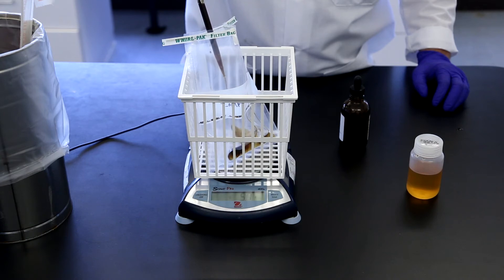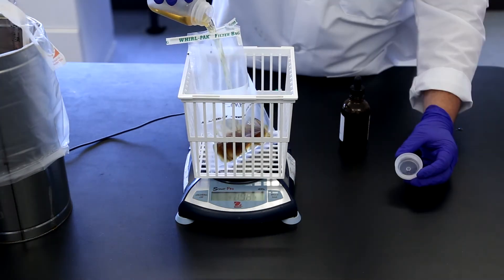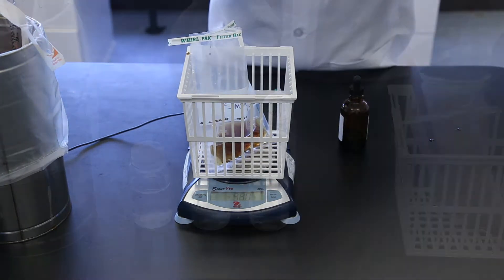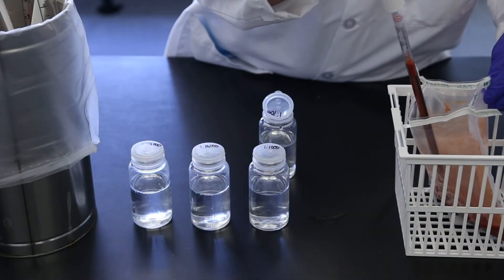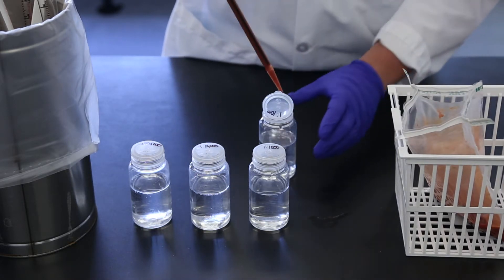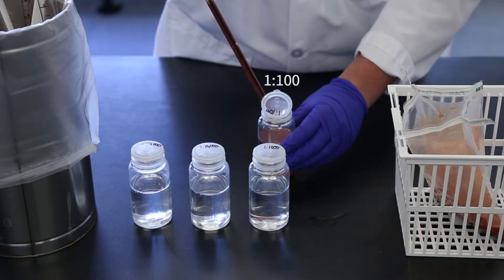For less than 10 CFU per gram, use a 1 to 10 sample dilution. For less than 100 CFU per gram, transfer 11 milliliters of a 1 to 10 sample into 99 milliliters of buffer.